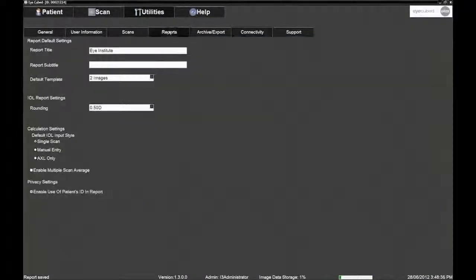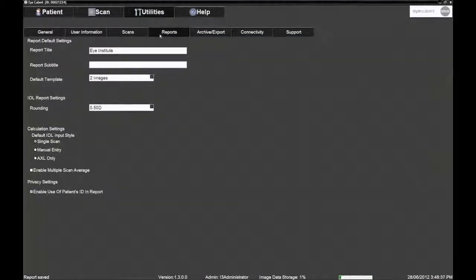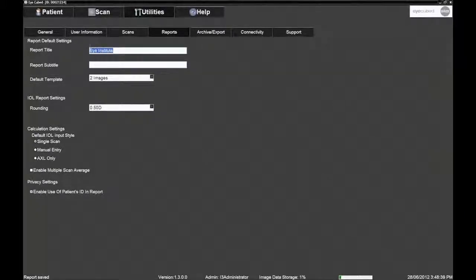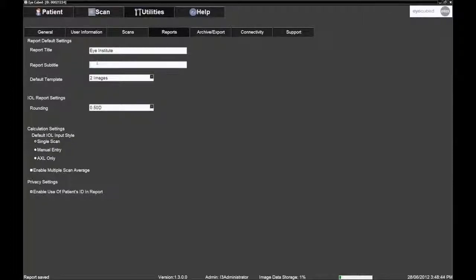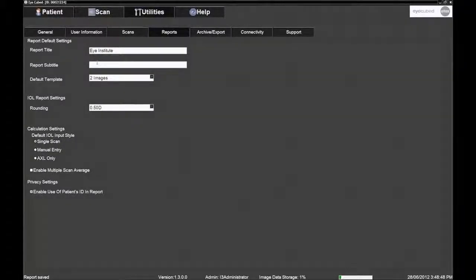These reports can be customized with a facility's name and address by inputting the information into the Report Title and Report Subtitle found on the Reports page under Utilities. This can only be performed while logged in as an administrator.